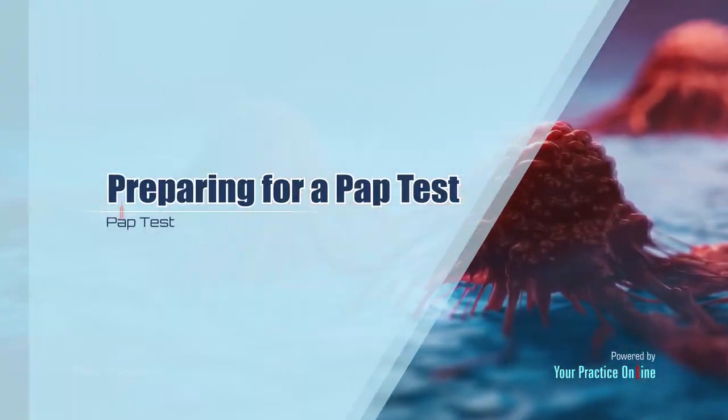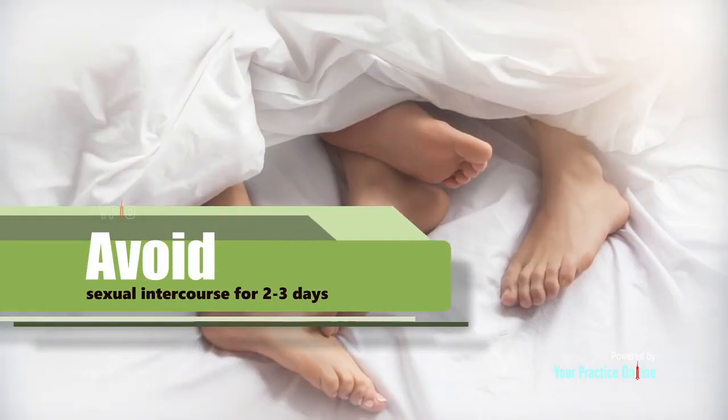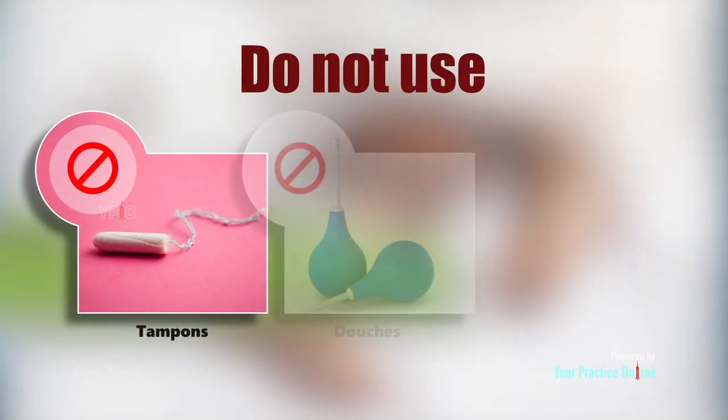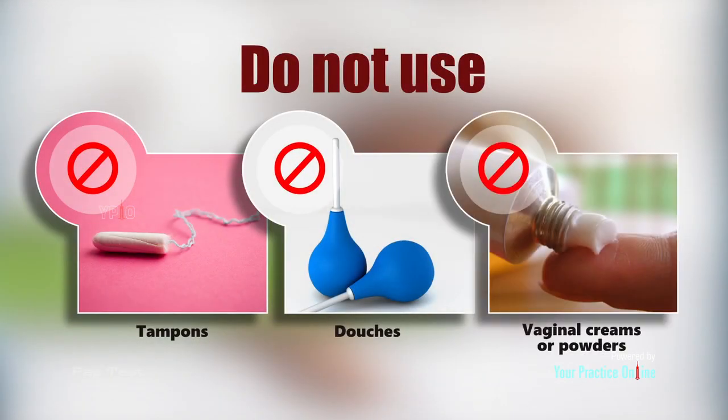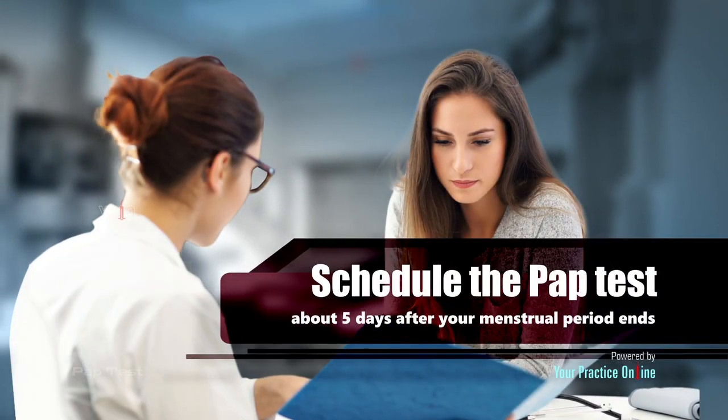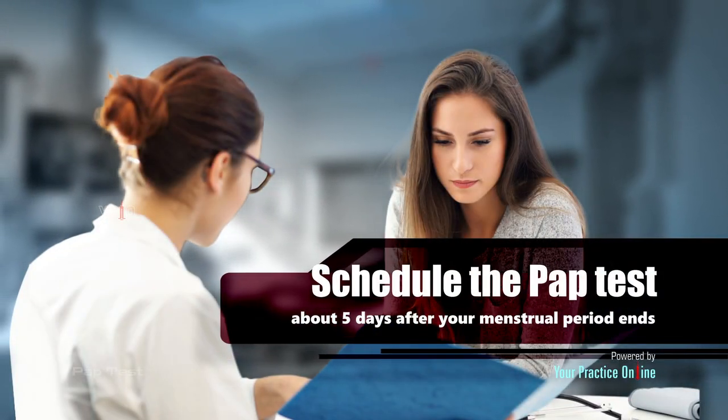Preparing for a Pap test. To improve the accuracy of the Pap test, you should avoid sexual intercourse for 2 to 3 days. Do not use tampons, douches, vaginal creams or powders, or birth control foams for 2 to 3 days to prevent washing off abnormal cells from the cervix. Schedule the Pap test about 5 days after your menstrual period ends.